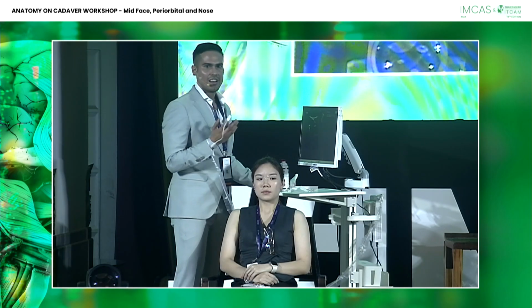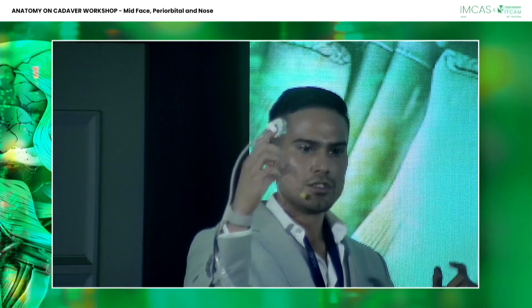Good. Okay. Welcome, everyone, and thank you for letting me make this demonstration. I am working here with a device which is very different than others because it is adaptable to your finger. So you can actually work, see, and inject at the same time. You can be experienced, you can know your anatomy, you can be skilled, but at the end of the day, it comes to what is below the skin of your patient. So using ultrasound will give you the opportunity to have this information and avoid problems.